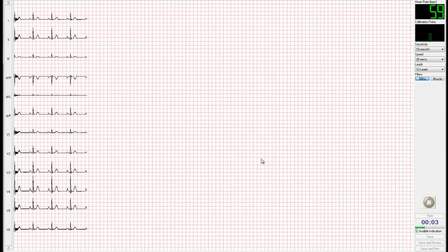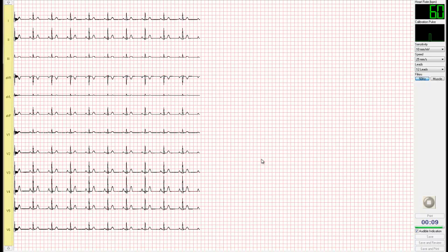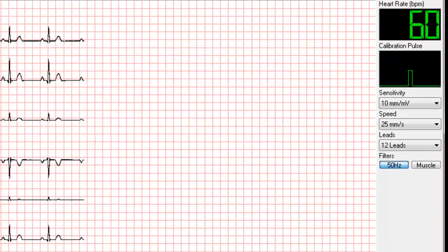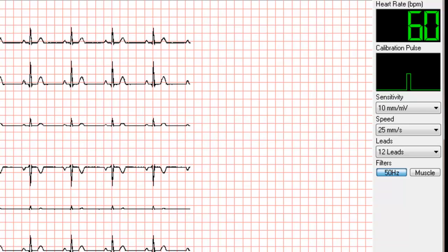The real-time ECG monitoring trace will now appear on the screen. Down the left-hand side of the screen, all 12 lead views are clearly labelled, and in the top right-hand corner, the patient's heart rate can be viewed.